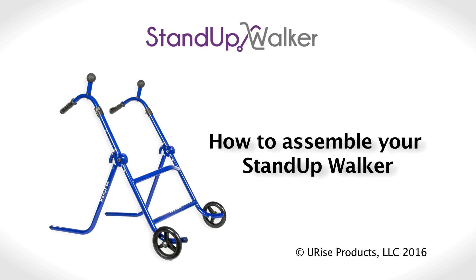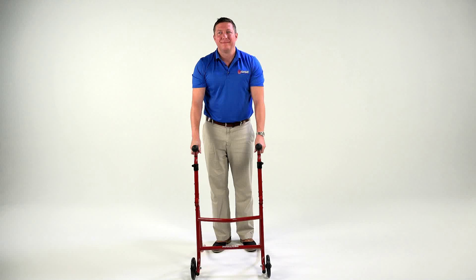Always refer to the instruction manual on proper use and fit for the stand-up walker. Here is how to assemble your stand-up walker.